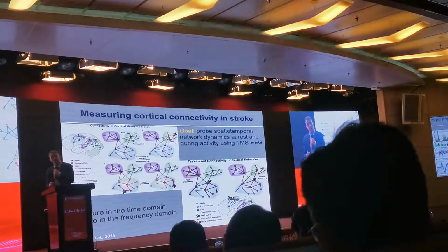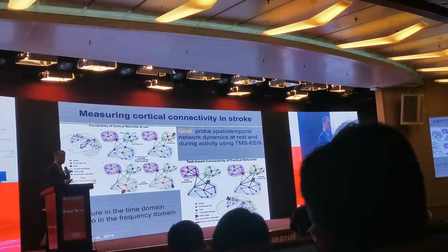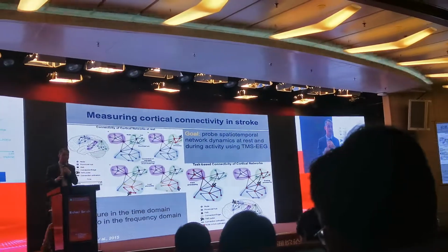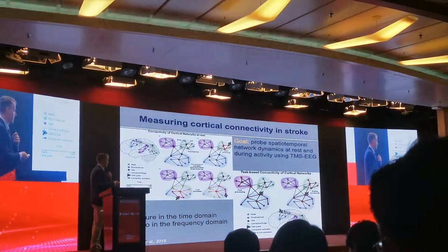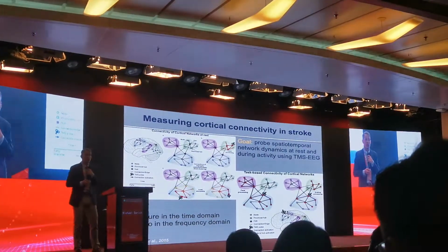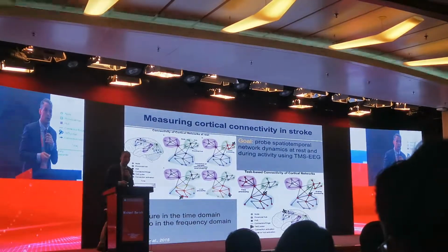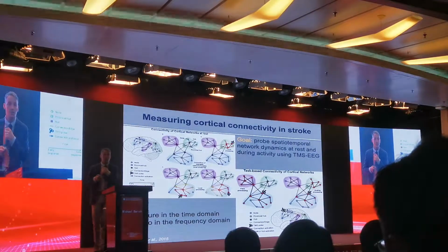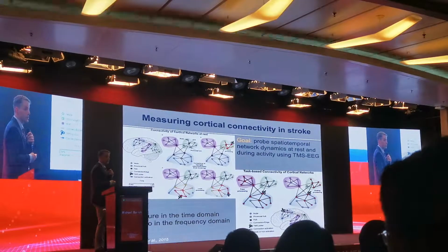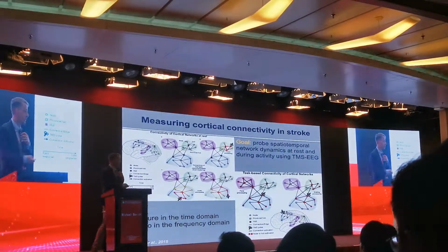And of course, I showed you earlier just a very simple example where if we stimulate the motor cortex, we can actually elicit changes in connectivity between the hemispheres, and this seems to be state dependent, an activity dependent process. So it opens up a window for us to ask very new questions about changes in cortical reorganization post-stroke. And that's really where our lab is going in the future, trying to develop sophisticated approaches to not only deliver and measure the stimulation, but also to analyze it.